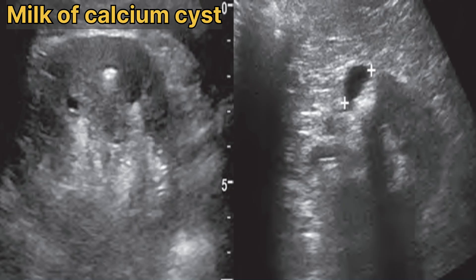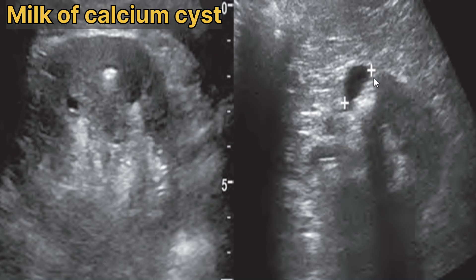Now we will discuss milk of calcium cysts. Crystalline material can accumulate in the cyst and produce shadowing echogenic material that may or may not layer in the dependent aspect of the lumen. A transverse view shows an echogenic lesion in the renal cortex — the cyst is too small to resolve any fluid, and only bright reflections from the crystals are seen. Another view shows a cystic structure with an anechoic lumen and highly echogenic crystalline material in its dependent aspect — this is the milk of calcium cyst.